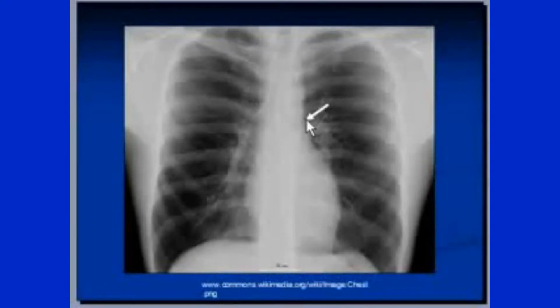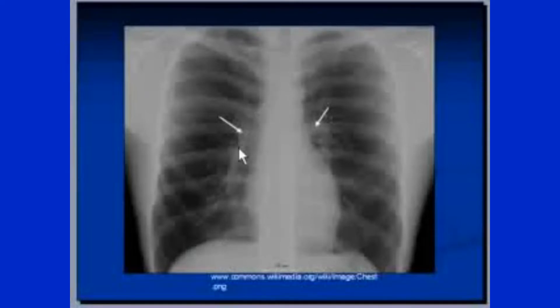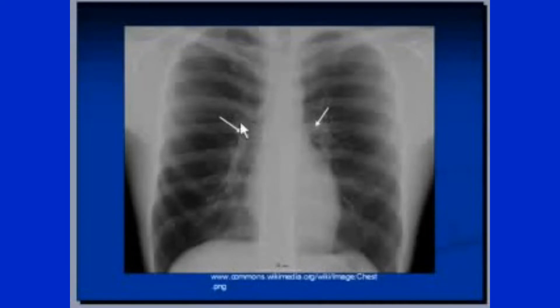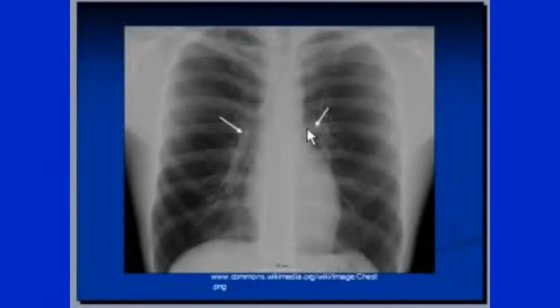This is the aortopulmonary window, which will disappear in case of any mass or enlarged lymph nodes. These are the pulmonary arteries — the right and left pulmonary arteries. The left pulmonary artery arches over the left main bronchus. On the right hilum, the highest point is the right main bronchus, whereas on the left side it is the left pulmonary artery.